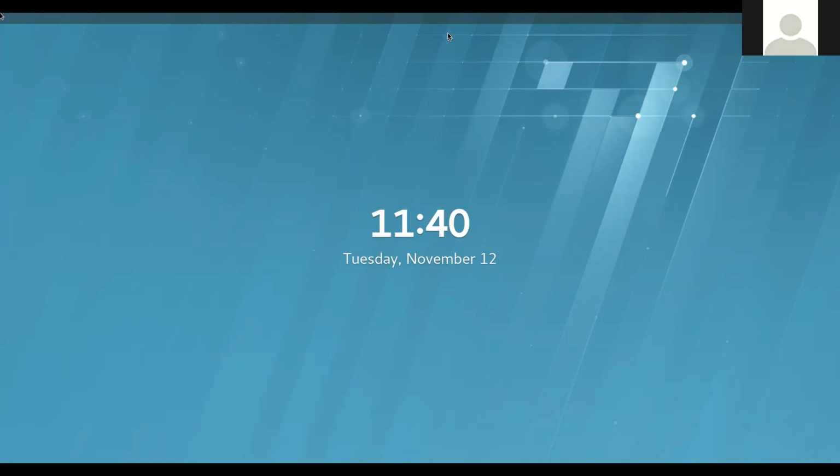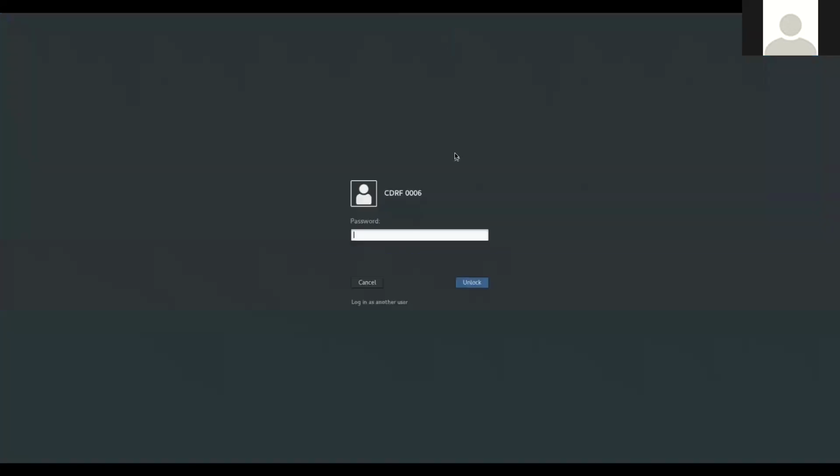In the meantime, we solved the SPM issue. That's what I quickly wanted to write down, and now my session here died. So, depth result. Let me quickly log in again. No, not that password. Oh, sorry.